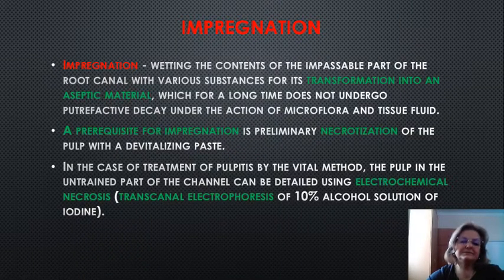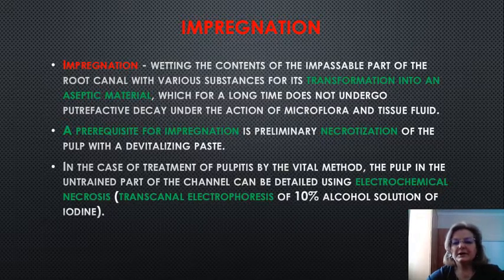Impregnation is the treatment of the contents of the impassable part of the root canal with various substances for its transformation into an aseptic material, which for a long time does not undergo putrefactive decay under the action of microflora and tissue fluid.